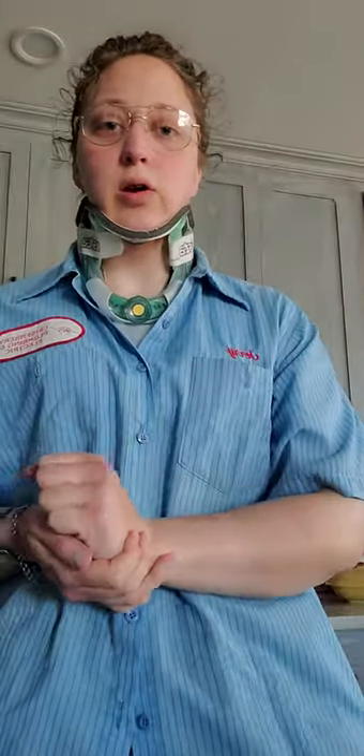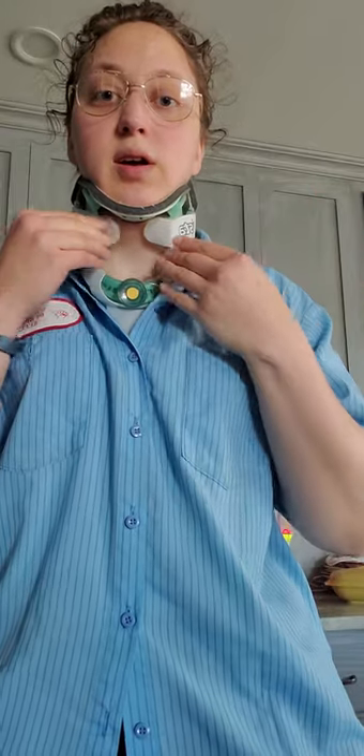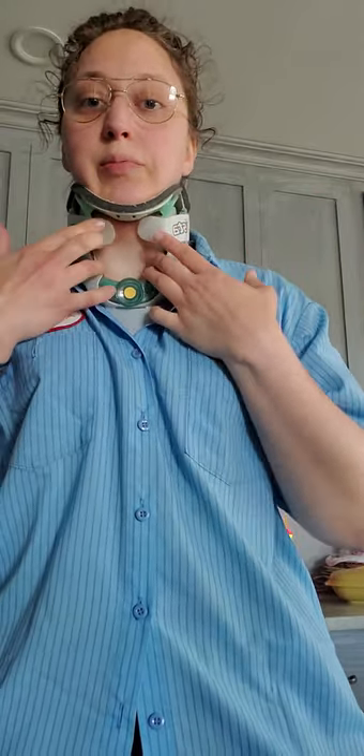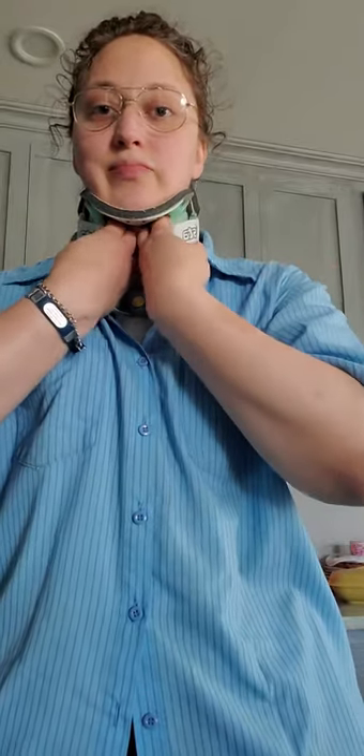I wanted to make a video sharing some tips for people who do a lot of bracing. I've been doing this with my neck brace for years. Most people have extra strap at the front of their brace — for me it's extremely annoying, I don't like the look of it. I see a lot of people just tuck them around, but it doesn't stay.